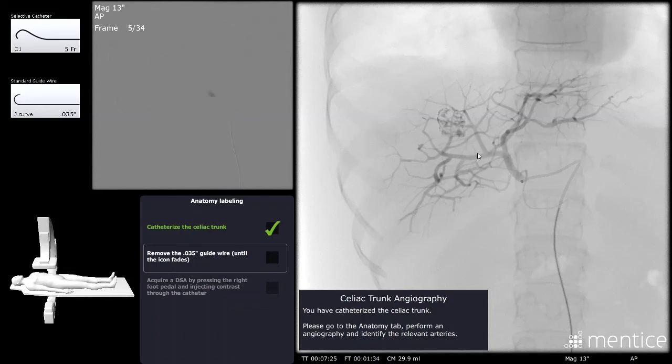And what you want to do, say in the setting of a DEB TACE, you want to get to stasis. So if you have injected all your particles which have been impregnated, then you would also want to consider injecting some bland particles after that, i.e. non-coated particles, as part of the procedure till the point where you get arterial stasis to the lesion. Okay, that is the key.